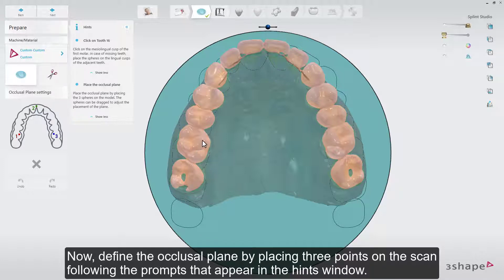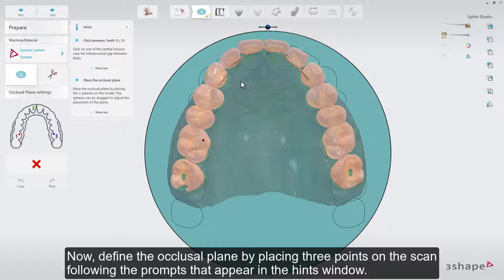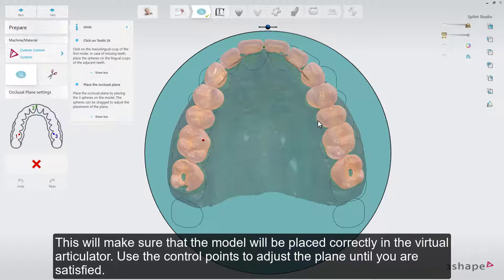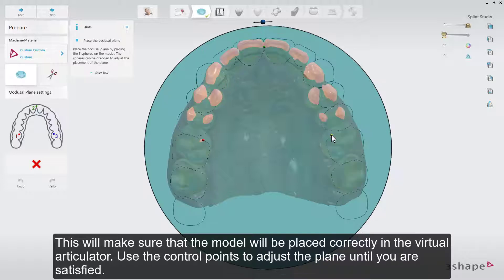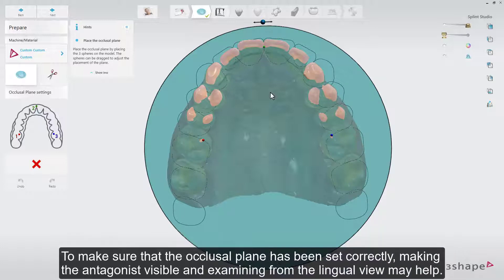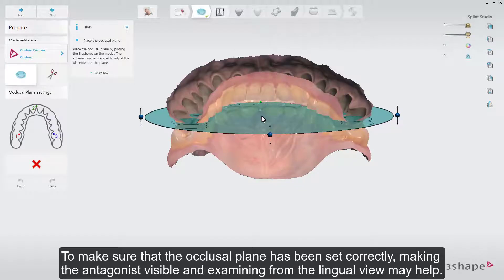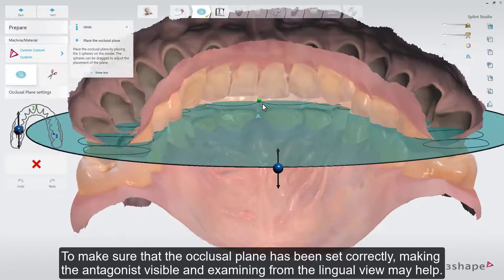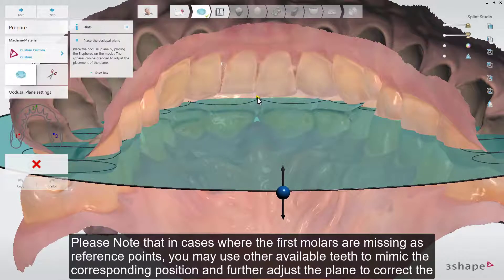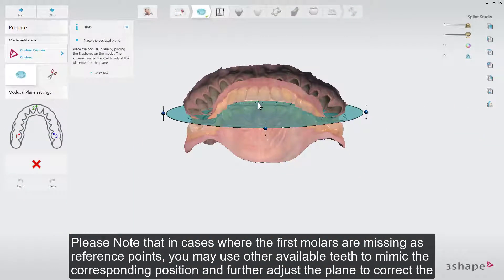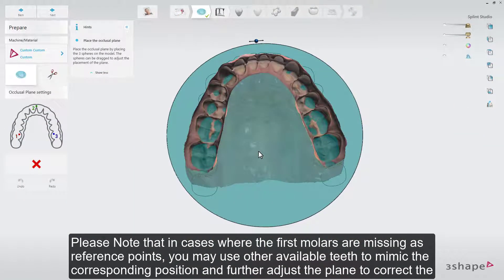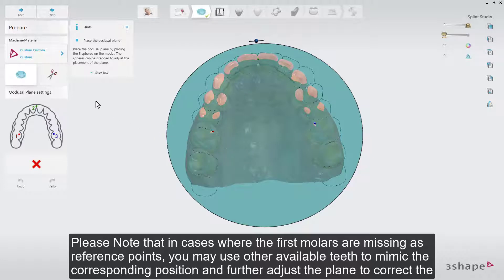Define the occlusal plane by placing three points on the scan, following the prompts that appear in the hints window. This will make sure that the model will be placed correctly in the virtual articulator. Use the control points to adjust the plane until you are satisfied. To make sure the occlusal plane has been set correctly, making the antagonist visible and examining from the lingual view may help. Note that in cases where the first molars are missing as reference points, you may use other available teeth to mimic the corresponding position and further adjust the plane.